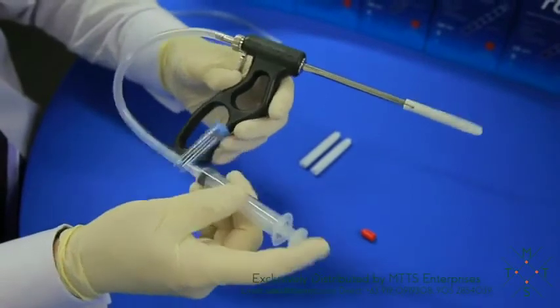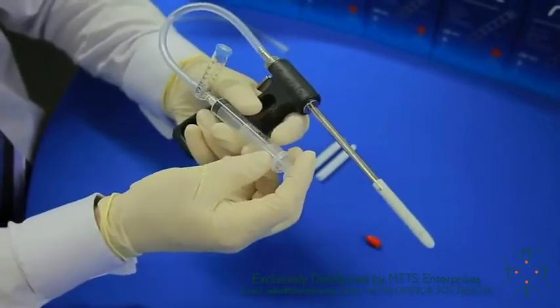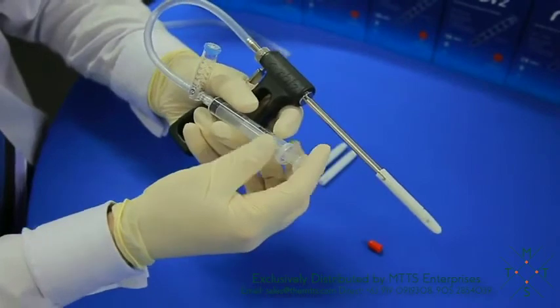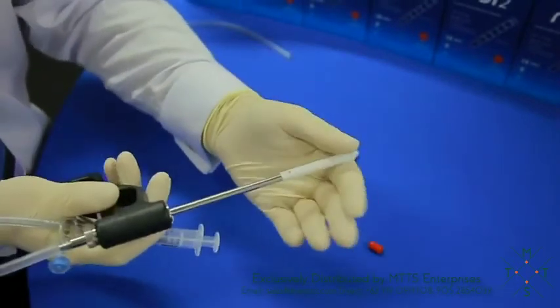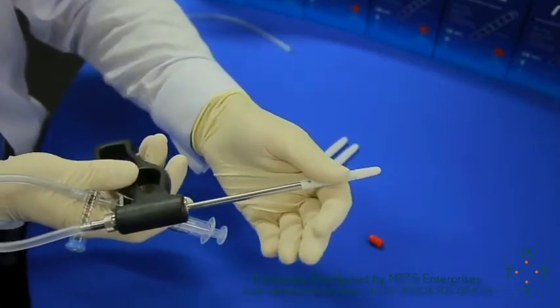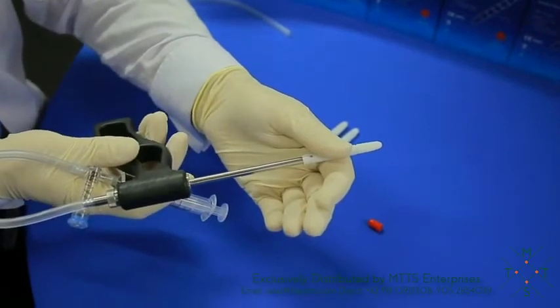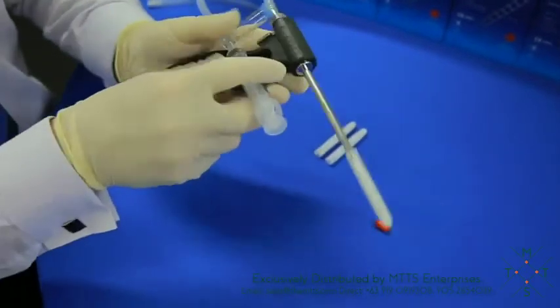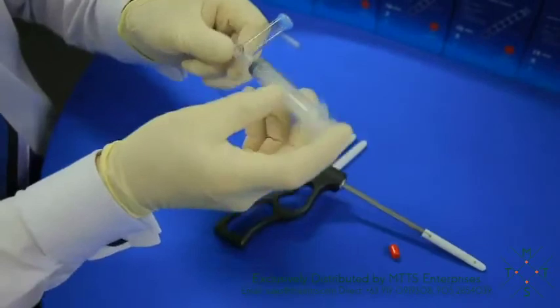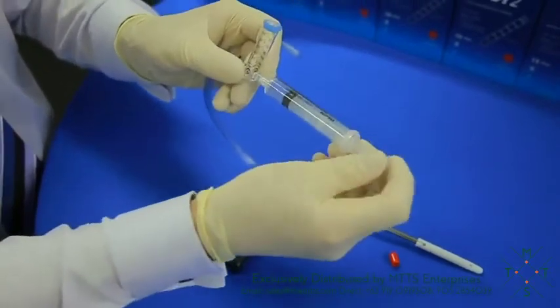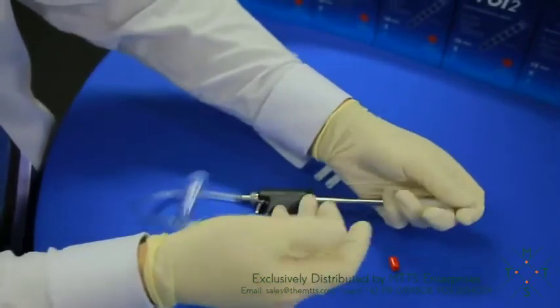We will then have an assistant on the syringe. You'll place the capsule into the rectum to the desired insertion depth, and you'll get your assistant to pull back on the syringe and tell you when you're at your desired suction.